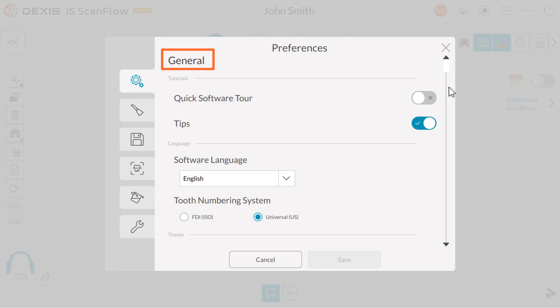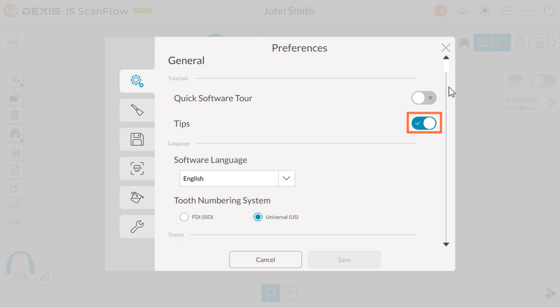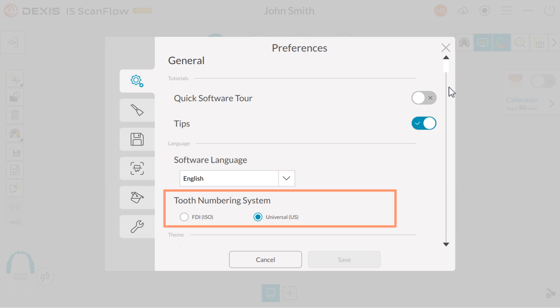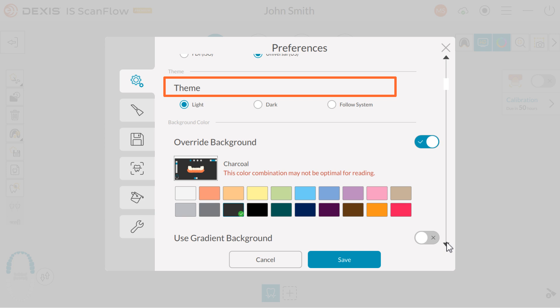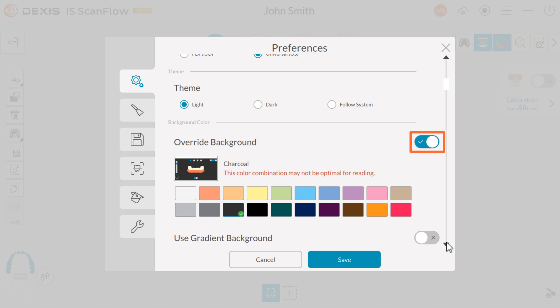Under the General tab, you have the following options. Tips: this option is used to view tips for certain features of the software — click the radio button to enable or disable this feature. Software Language: click the drop-down arrow to choose your default language. Tooth numbering system: select your tooth numbering system. Theme: the options for your background are Light, Dark, and Follow System. Enable the override background color option if you prefer a contrast between your background and button colors. After enabling override background, choose your background color. A warning message will be displayed if your color combination is not optimal for reading.